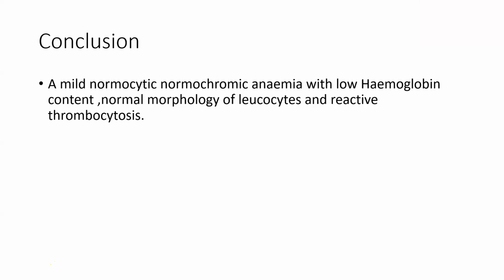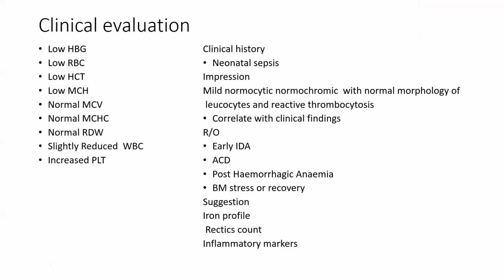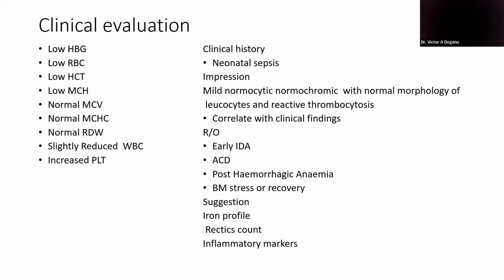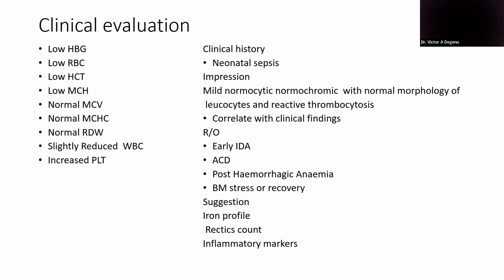Yes, my concern has to do with the leukocytes. I noticed that you indicated a normal morphology of leukocytes. Given that we have not had the chance to view the film, how do we come about the normal morphology? Though the total WBC count and probably the numerical values of all the differentials. Exactly. So it's an assumption that we are doing.